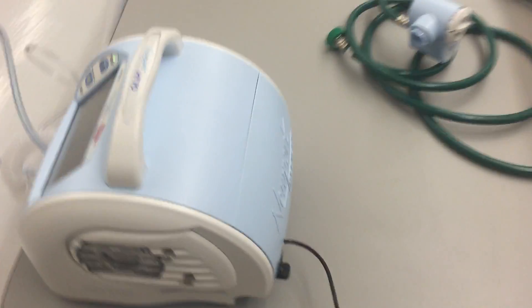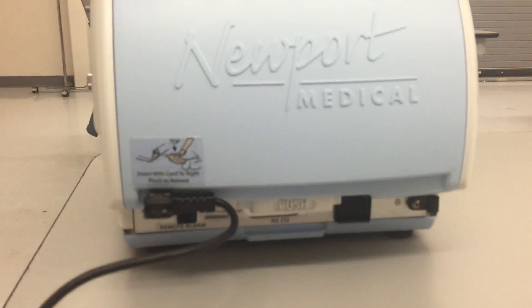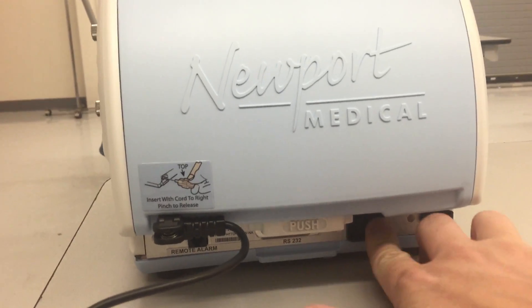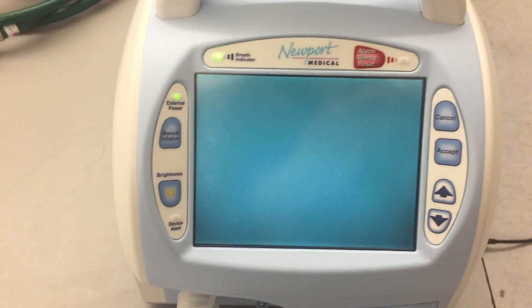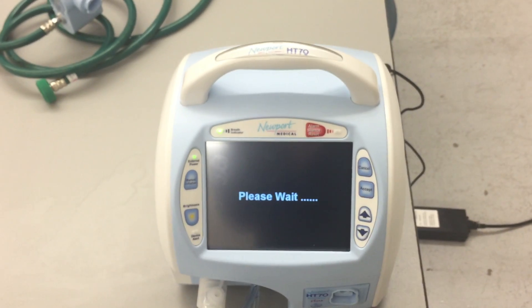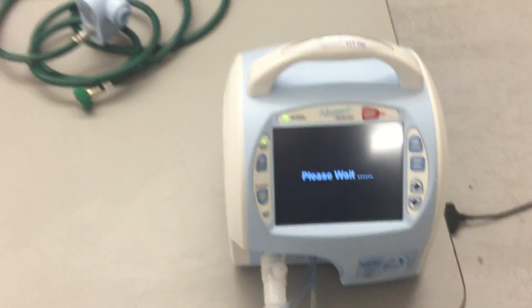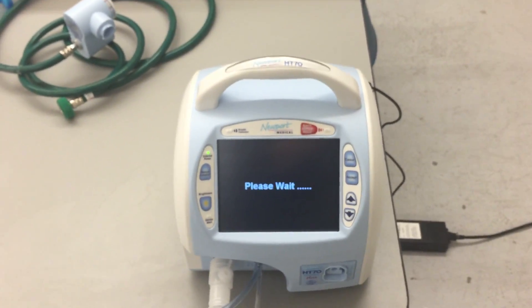So let's go ahead and turn the ventilator on. The on-off switch for this particular ventilator is going to be right back here. You can see the switch right down here, so I just push that. The ventilator will turn itself on, and it will take a few seconds. It'll let you know it's starting up, and it'll tell you to wait — it'll just take about 30 seconds or so to run itself through.